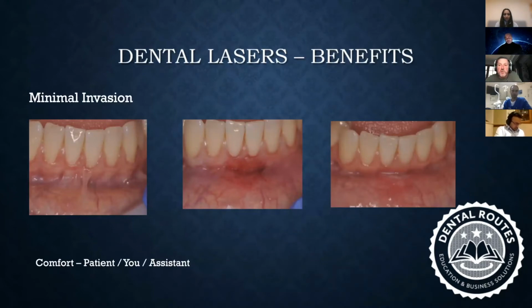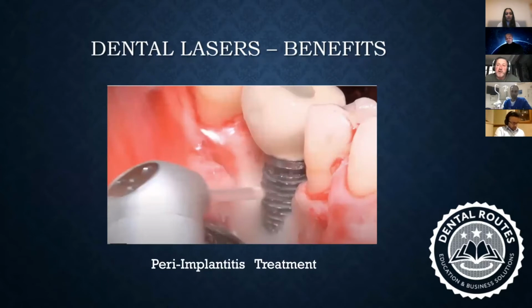Okay. Just a question with the peri-implantitis, because obviously it is a very hot topic, and it's going to become more and more. Let's just say that other people in the team, could a hygienist use a laser? You know, they're forever being asked to manage around the top of implants that have problems. I guess a laser could be used by a hygienist as well. They just need to get their module 1 laser certification, and then they could actually use a laser too, I'm guessing.